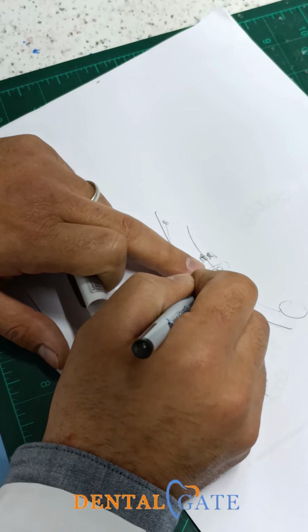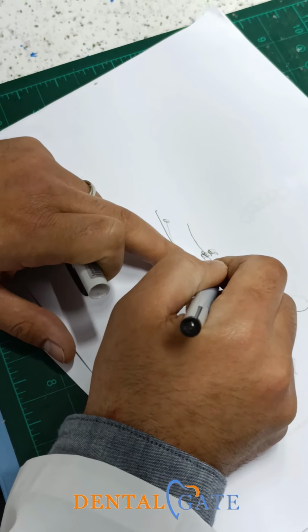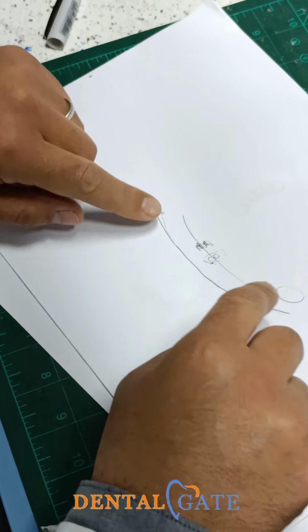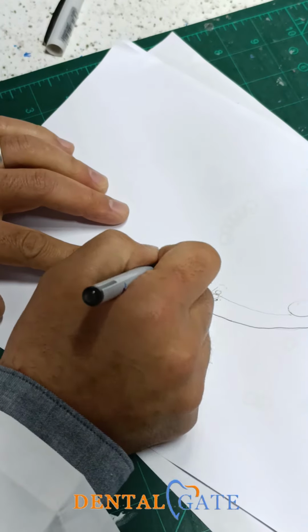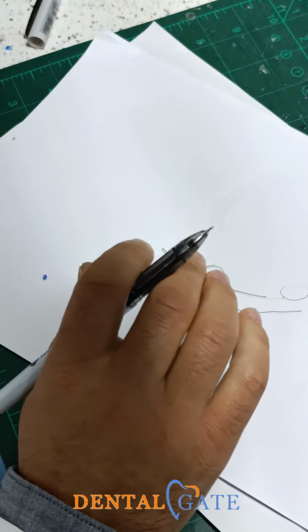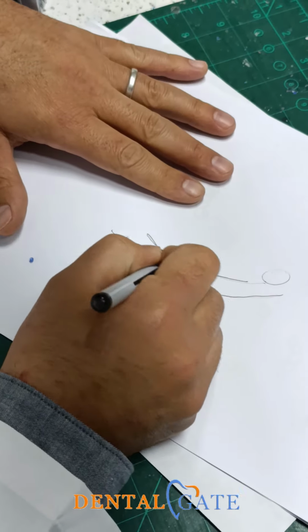When I put it with the two cusps on that table, I mean my objective now, this curve will be meeting in this area. We have a curve here, we have a curve here, because we will start with the curve and follow the other one. The second premolar represents the neutral one in the plan. There is no curve here.